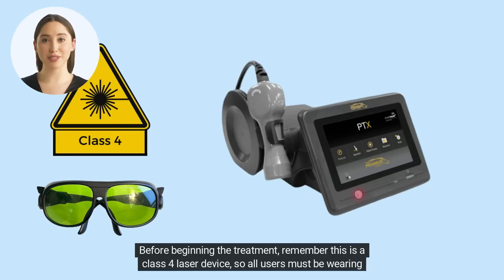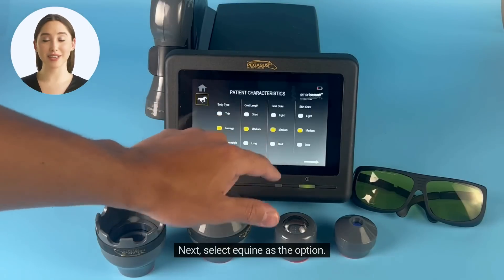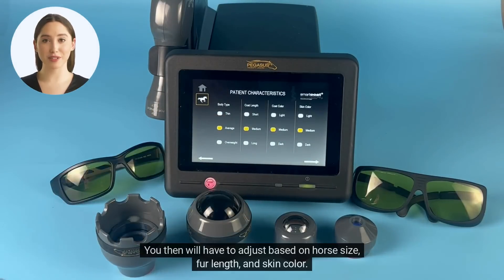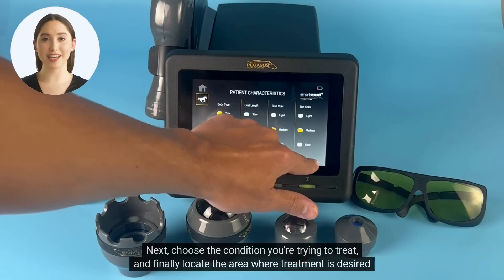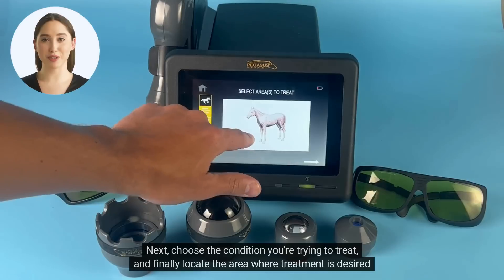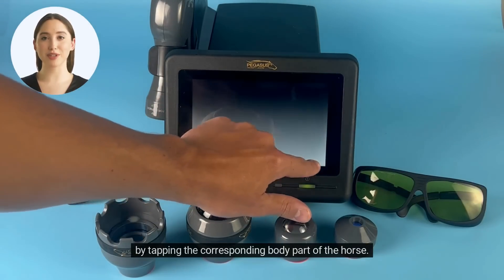Before beginning the treatment, remember this is a class 4 laser device, so all users must be wearing safety glasses. Next, select equine as the option. You will then have to adjust based on horse size, fur length, and skin color. Next, choose the condition you're trying to treat, and finally locate the area where treatment is desired by tapping the corresponding body part of the horse.